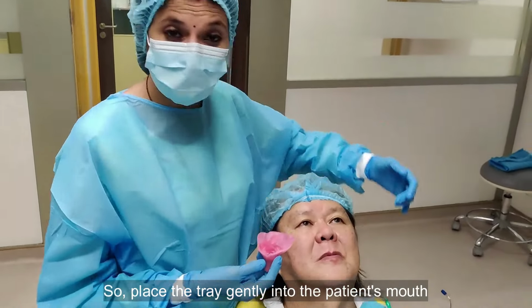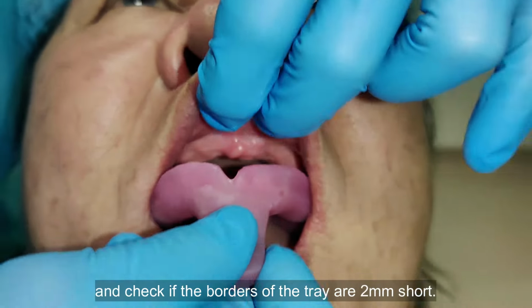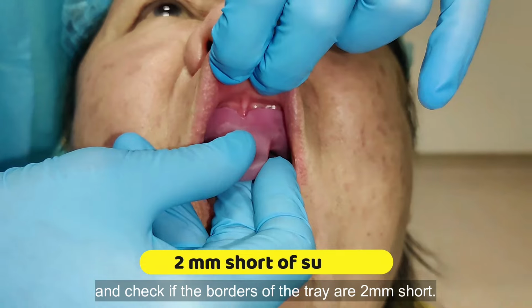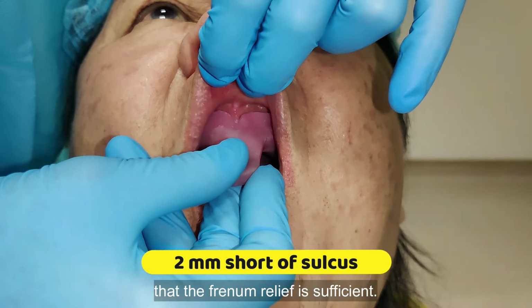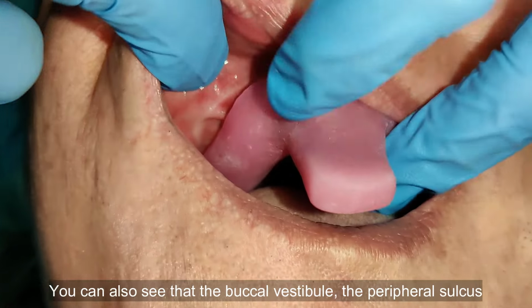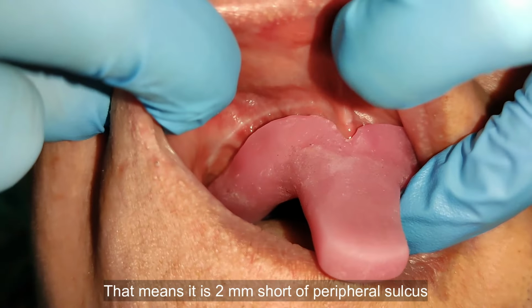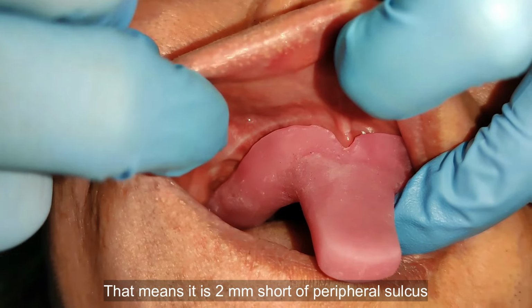So place the tray gently into the patient's mouth and check if the borders of the tray are 2 mm short. You can see here that the frenum relief is sufficient. You can also see that the buccal vestibule there, the peripheral sulcus, is not being contacted by the tray. That means it is 2 mm short of the peripheral sulcus.